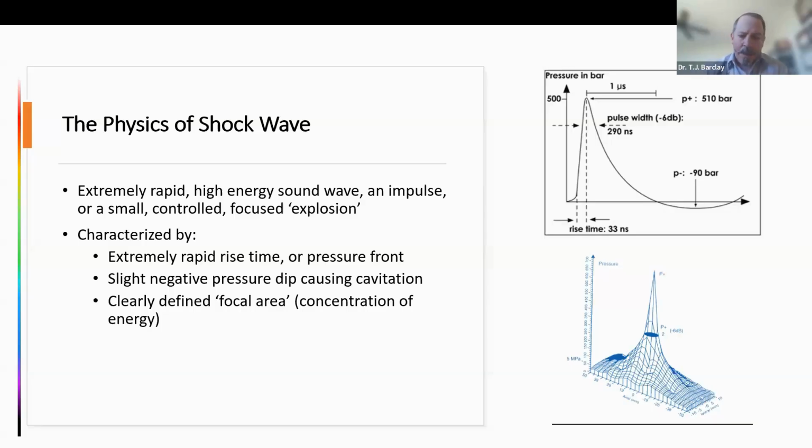The other thing that we tend to talk about with therapeutic shock waves is the focal zone. With the shockwave generators that we're going to discuss today, we're limiting our discussion to focused shockwave.